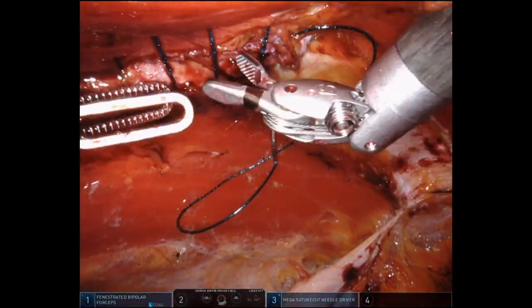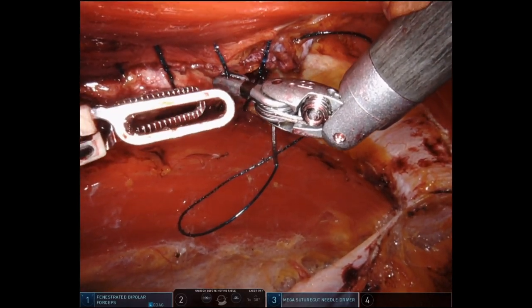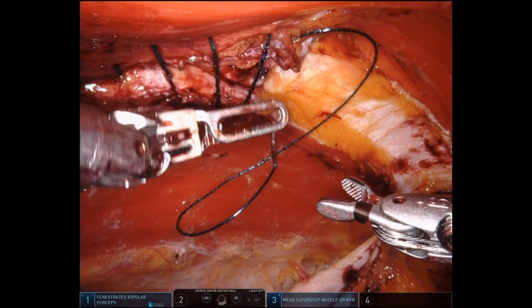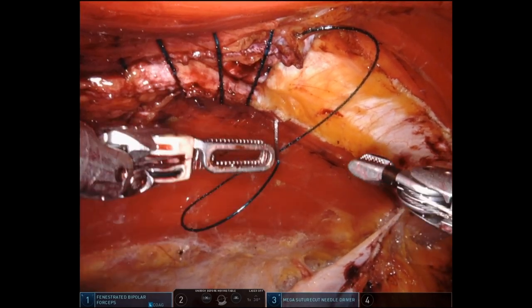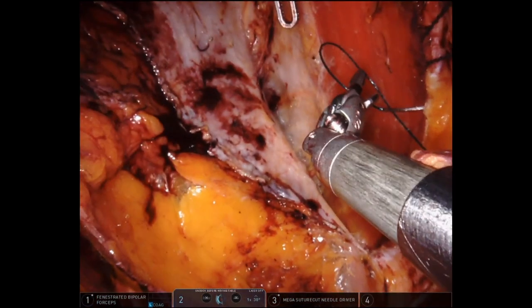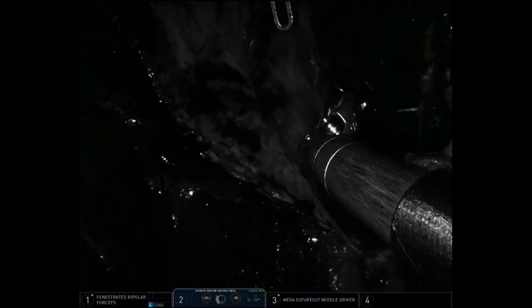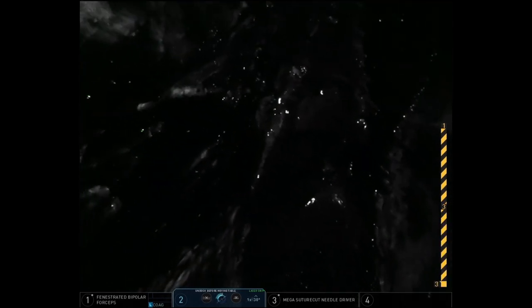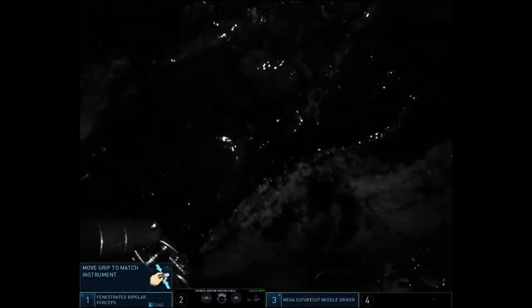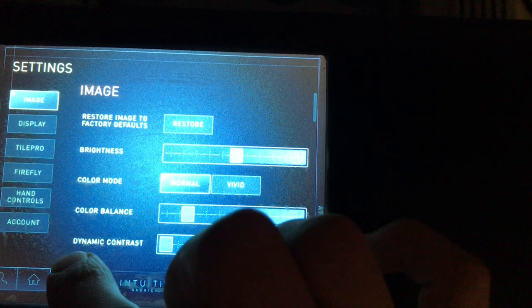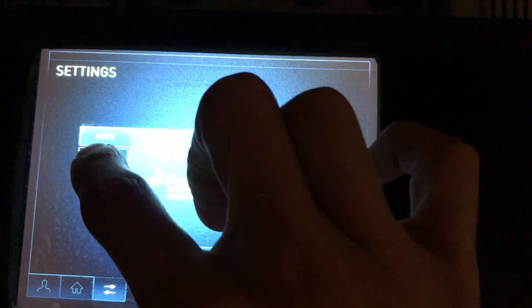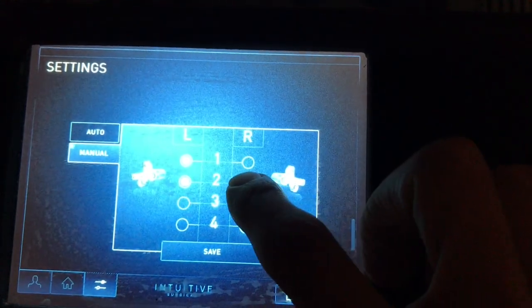So what I'm going to do is invert the image and reassign the instruments, using my left hand as my right hand and my right hand as my left hand. I drive the scope upside down, and as I do the camera clutch and finger clutch it frequently activates Firefly. Then go to the touchpad, choose hand control, configure, manual, and reassign the instruments.